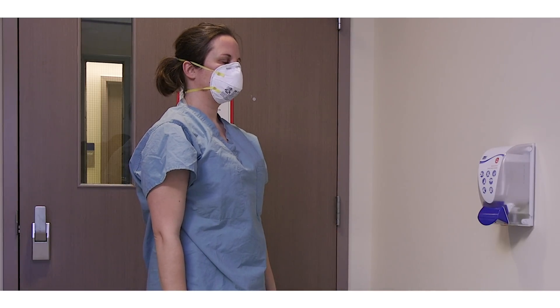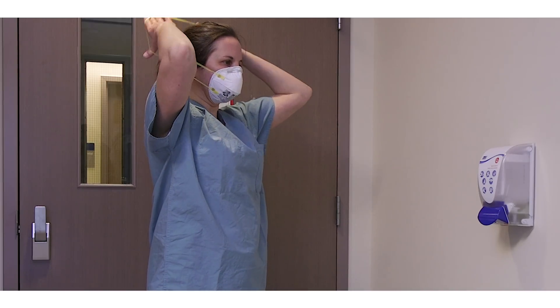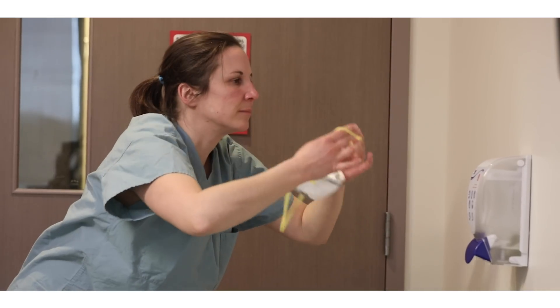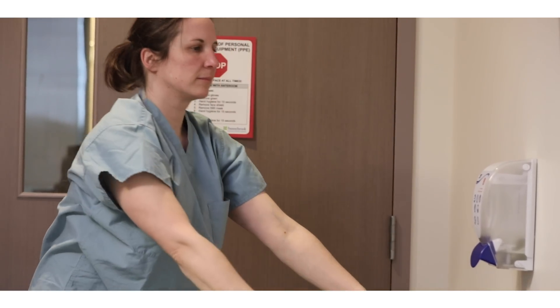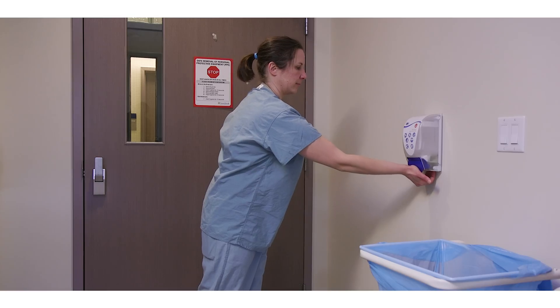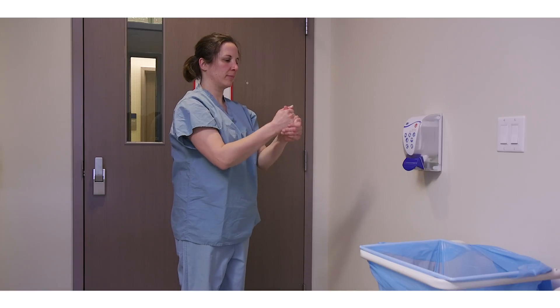Remove your N95 mask without touching the exterior part of the mask, again using the sniff position. Remove one strap at a time, starting with the bottom strap first and removing the top strap last. Remove the straps by grasping them from the back of your head. Dispose of the N95 respirator in the garbage, then perform hand hygiene.